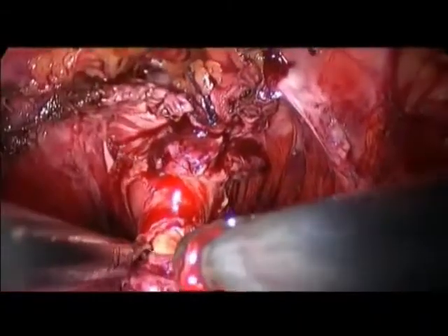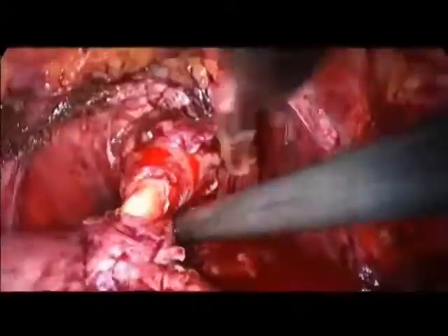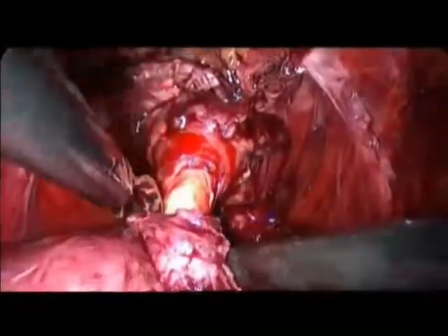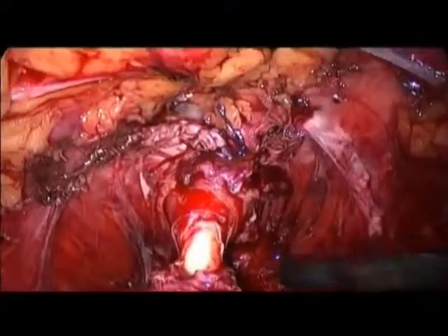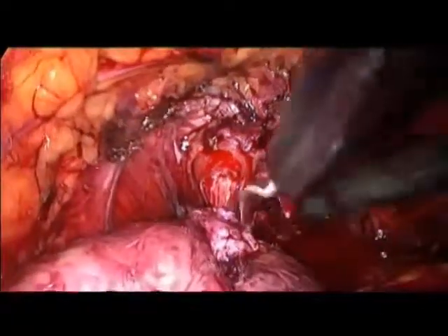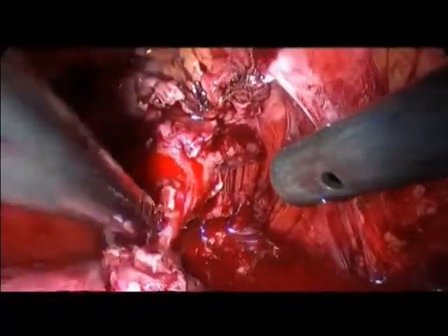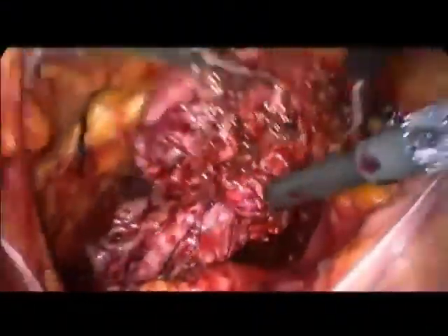Roland? Yes, we are completing, as you can see, we have completed the nerve sparing on both sides, and the prostate is totally free except for its caudal attachment with the urethra. We can now retrieve the catheter till the level of the division, and what we should find just behind is the terminal plate of the Denonvilliers, but it was already far dissected, so that the prostate is free.